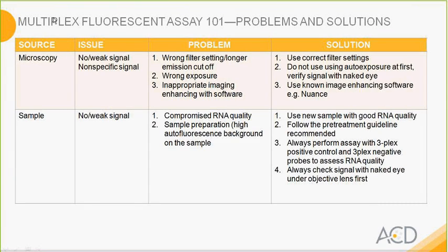So in summary, for multiplex assay, two issues tend to prevail: microscopy and the sample. For microscopy, usually make sure that you have the right filter settings. Make sure your exposure is according to what your microscope settings indicate. And also, before you set up your exposure, make sure that you're seeing the signal with your naked eye first.